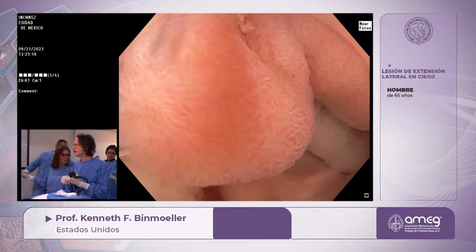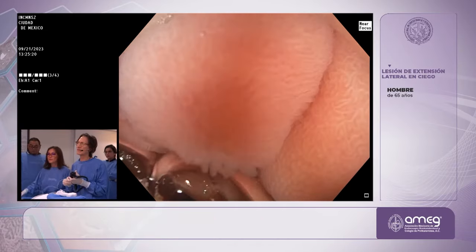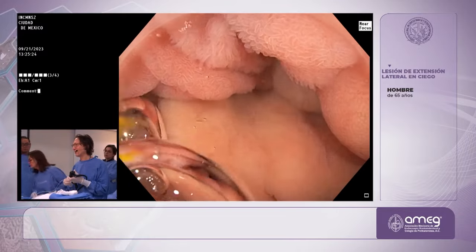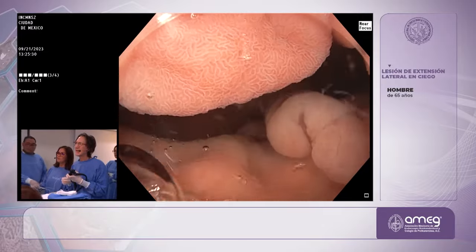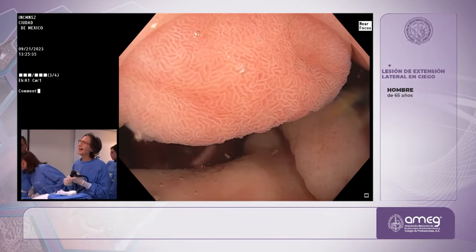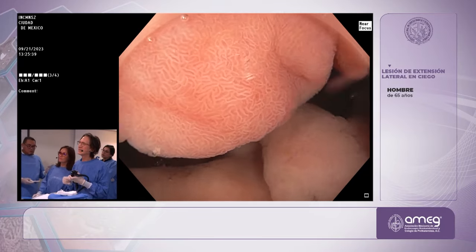And the gas is turned off, correct? I want to make sure. Yeah, so we want gas turned off. Yeah, it's off. Okay. And someone's keeping their eye on the water bottle, yes? El agua, right. ¿La estás viendo? So the enemy of water is air. And we don't want any air in here. It creates the air bubbles.